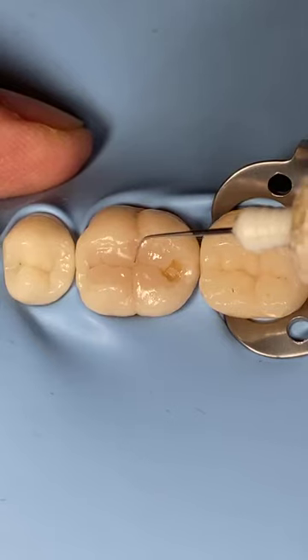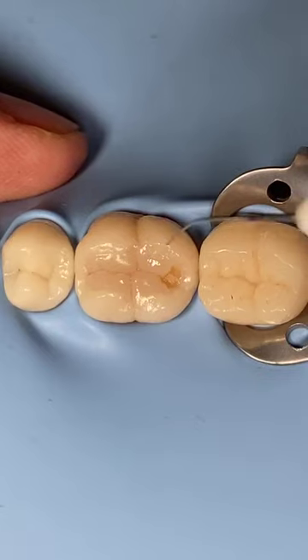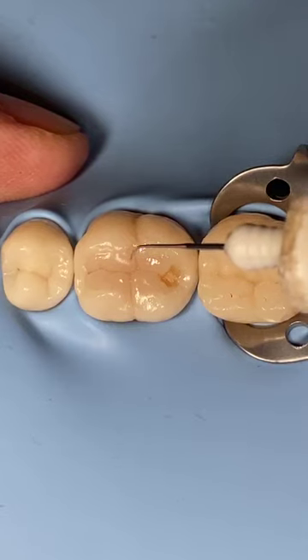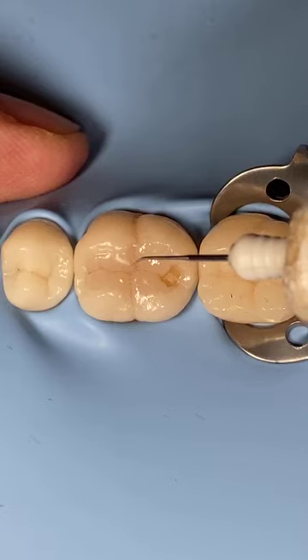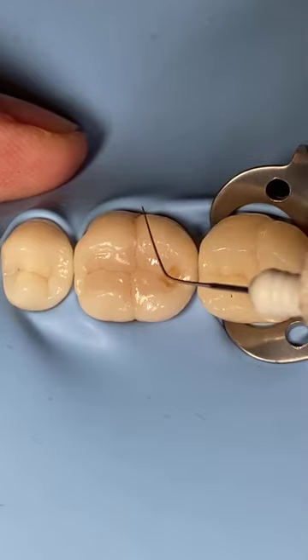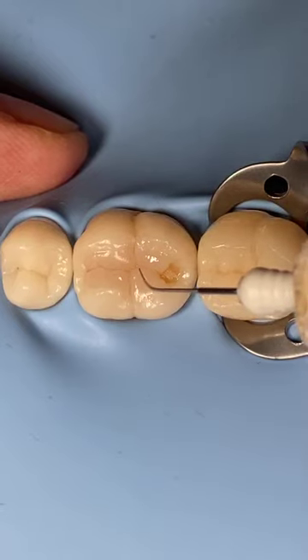Just drawing. Not like this. Use your uncured resin as your guidance. Make your cured resin next to the uncured resin as your guidance to create the drawing. You can remove the excess here. And then draw. It's very simple, very easy.